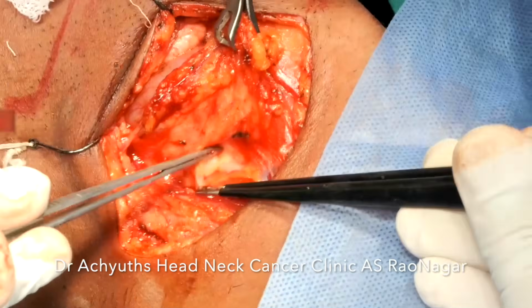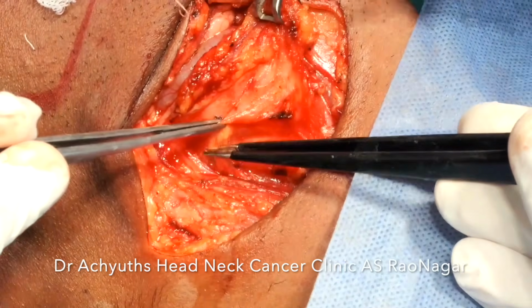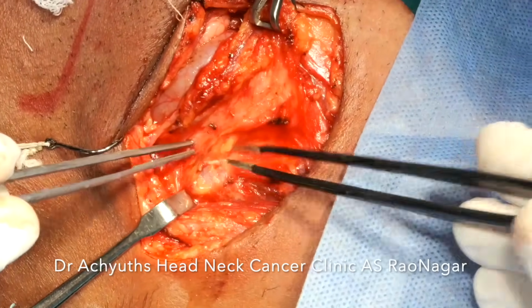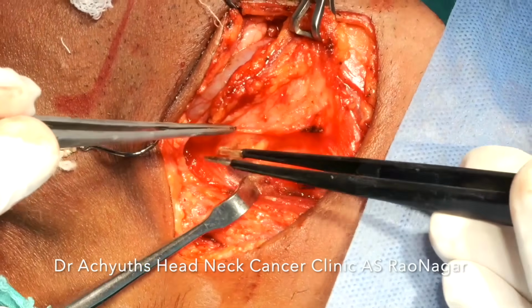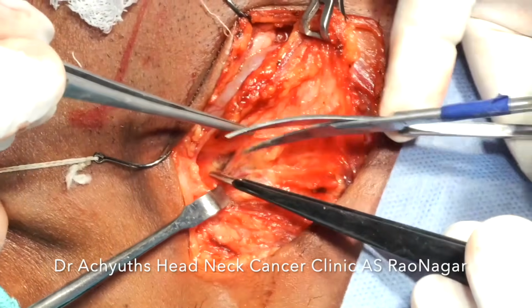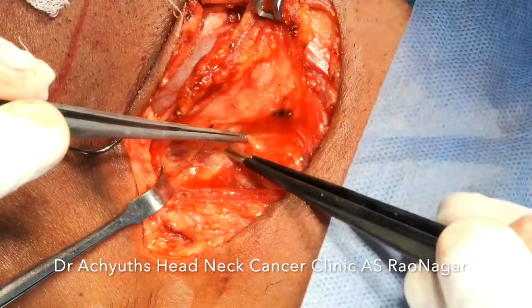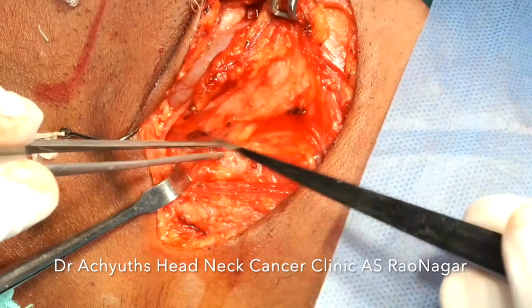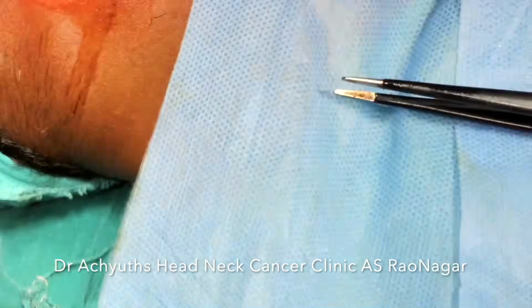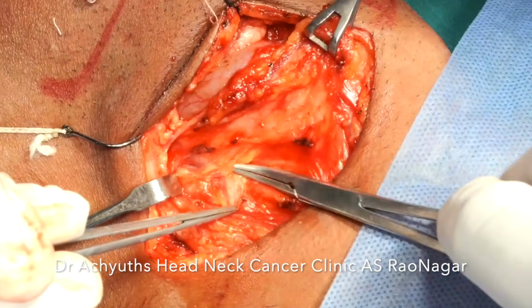So here we are almost dissecting over the carotid fascia, carotid sheath. So we have to be careful that we may encounter the IJV, the carotids, and if they are more separated, then we will get the vagus also. And over the carotid sheath we usually find the ansa cervicalis.